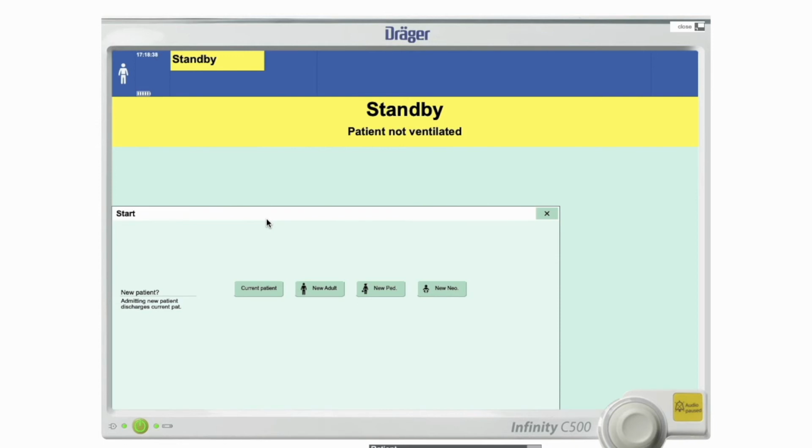Retrieval teams tend to leave the patient on their system, hand over, and then move the patient over, whereas theatre teams would like to move the patient over, get him on the vent, and hand over after that. But either way, you should be ready for both, or you may decide, depending on the patient's condition, what would be best for the patient. Either way, you would come and you would meet a ventilator that looks a little something like this.